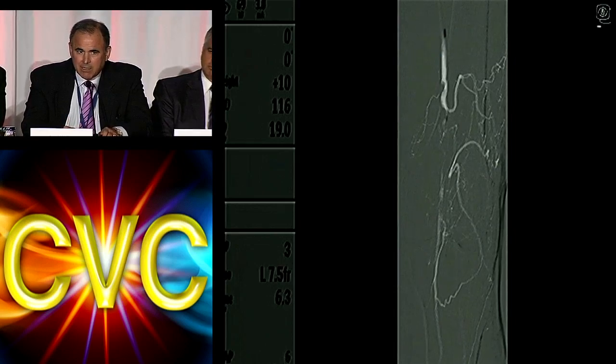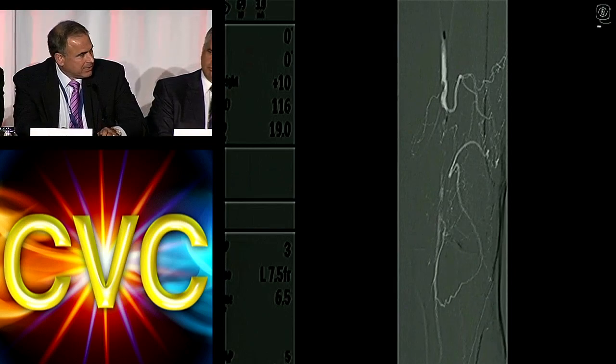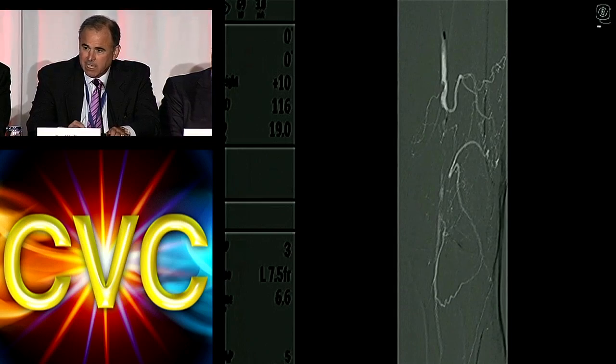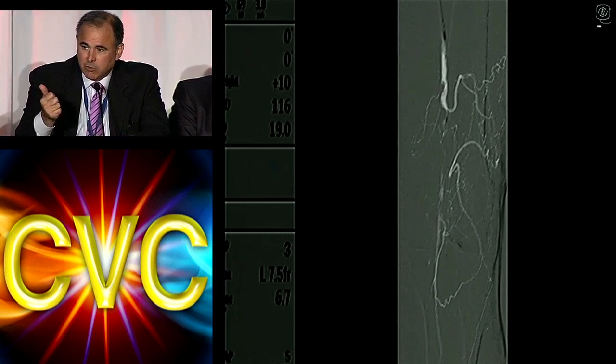Yep. You know, we make a lot about IVUS. We make a lot about calcium. But no one's ever shown that removing calcium matters as long as you can cross and dilate and ultimately deliver therapy, perhaps with the one caveat of us not knowing what happens with drug elution therapy at that point. Calcium is a big problem. I don't want to suggest it's not. It makes it harder to cross.